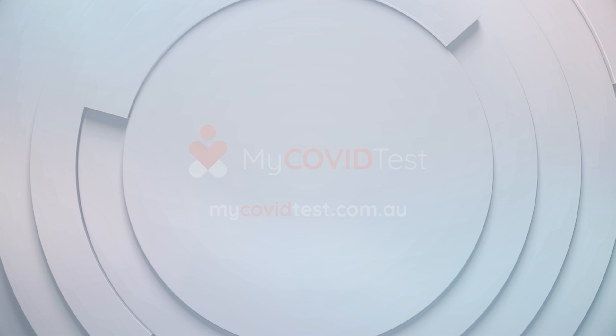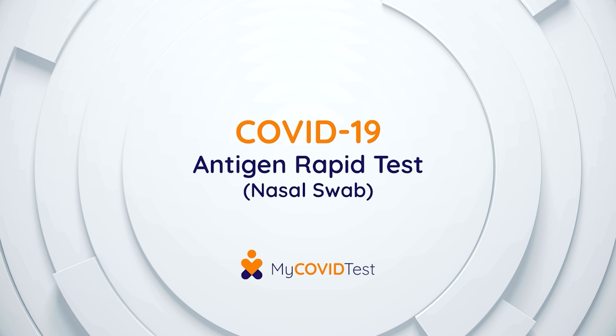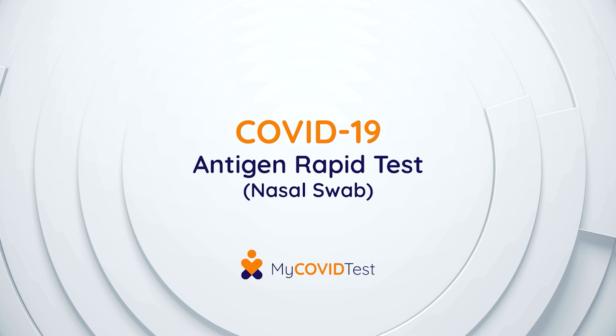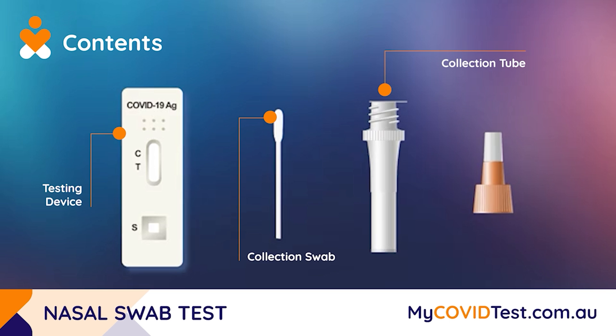Our COVID-19 Antigen Nasal Swab Test is a simple-to-use kit with minimal discomfort to the user. There are four main components that you will find contained within your testing kit: the testing device, collection swab, collection tube, and collection cap.